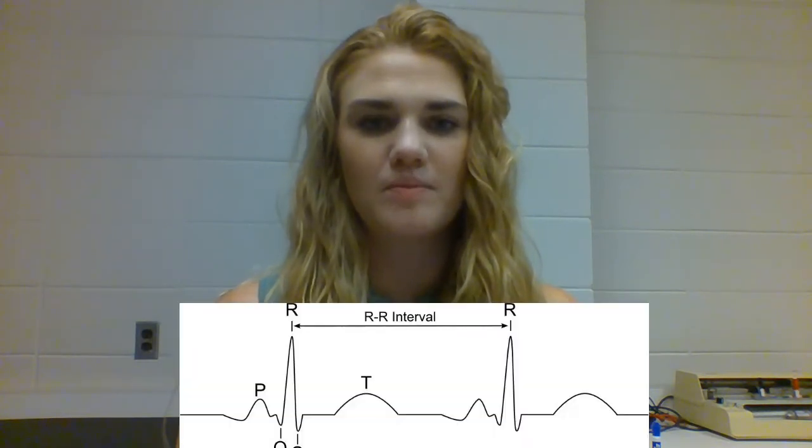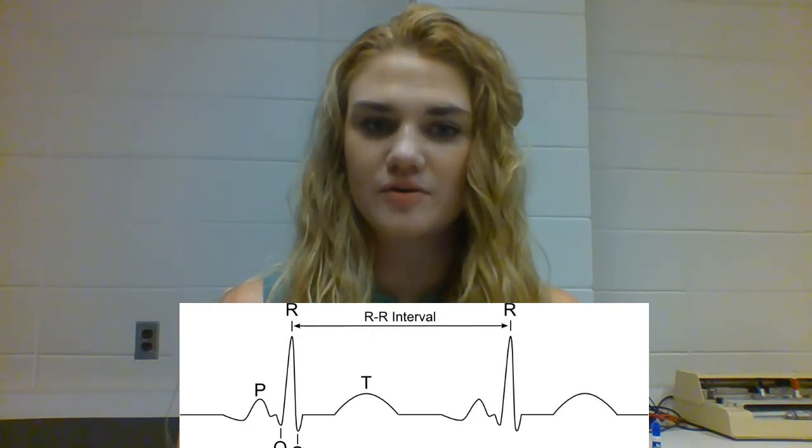Determining heart rate from an ECG recording is identifiable by what is reflected as the R to R interval, the R inflections of the QRS complex from 2 cardiac cycles. To determine heart rate, you will find the R peaks of 2 consecutive cardiac cycles. Then you will count the number of small or large boxes between the 2 R peaks.